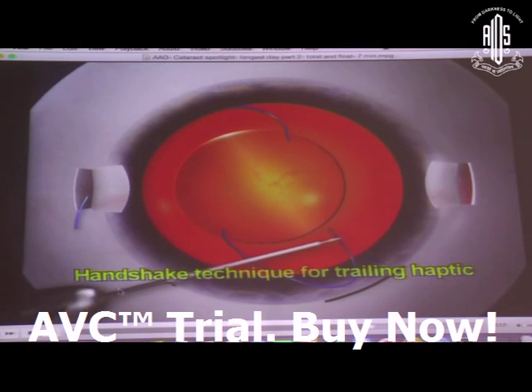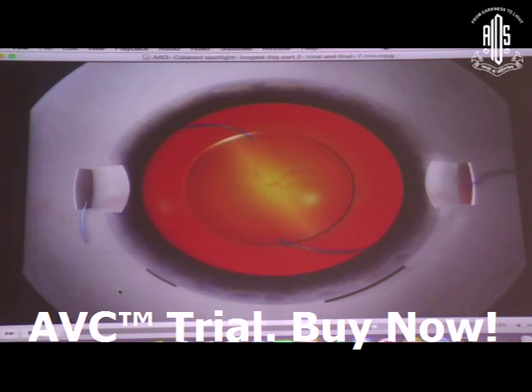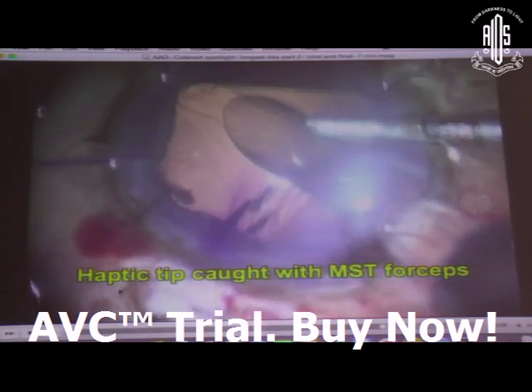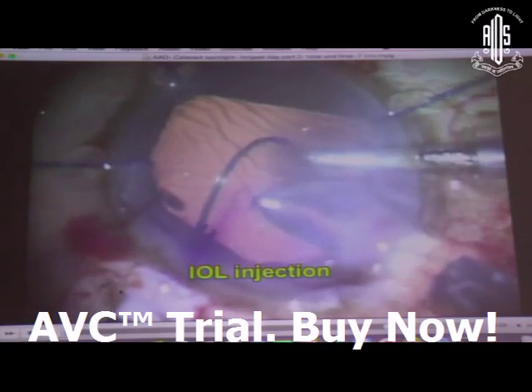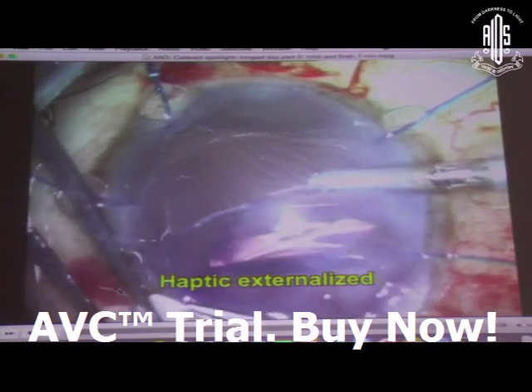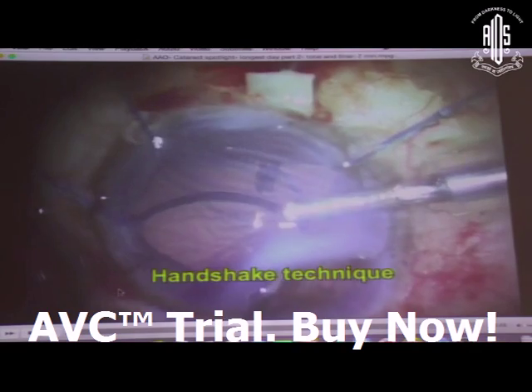So what I did was, I took my IOL and I started implanting my IOL inside the eye. Remember, there is one mark on one end of the cornea. On the other end, if you see, there is no mark. So I catch that haptic, I inject it inside. Once the IOL is gone in, I externalized it. So far so good. I thought now I'll do my handshake technique, and I have externalized my second haptic.